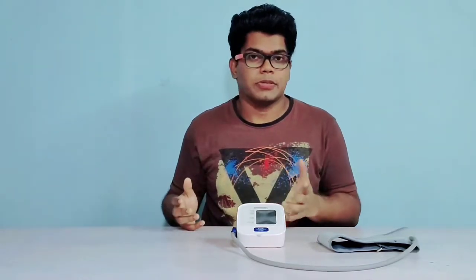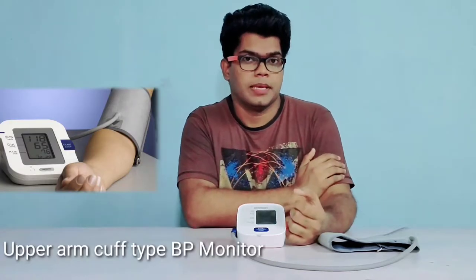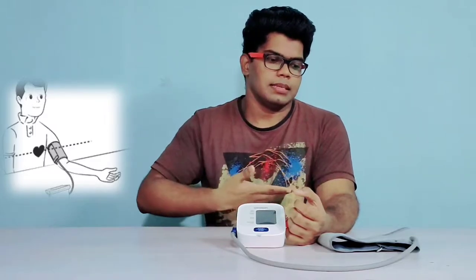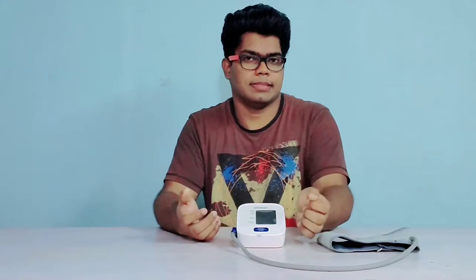Home blood pressure monitors are usually of two types: the wrist type and the upper arm cuff type. The upper arm cuff gives more accurate readings because the arm cuff remains at the level of your heart. That's why the readings are somewhat more accurate than the wrist type.